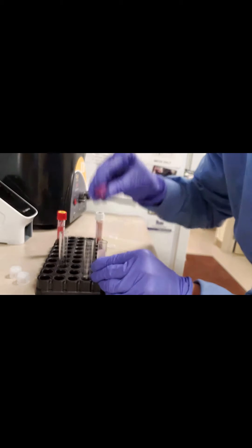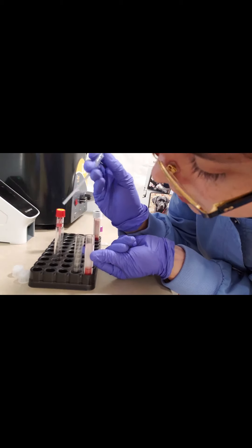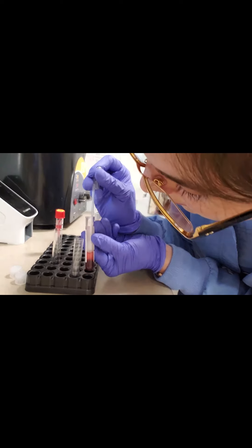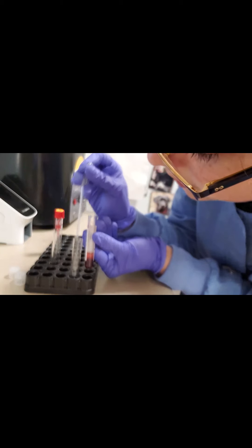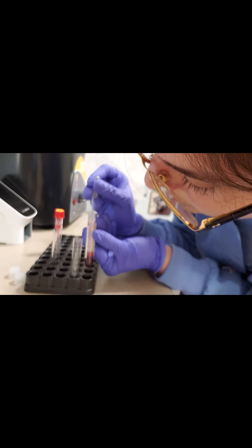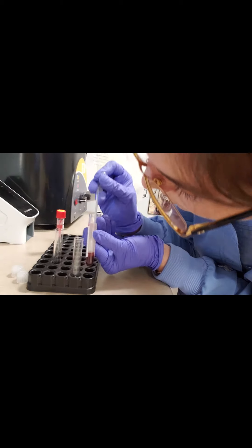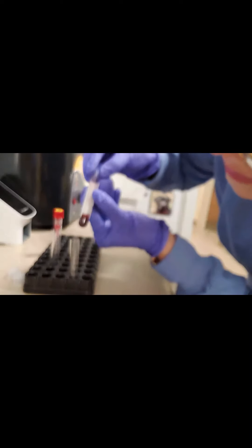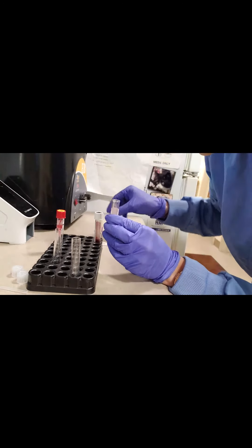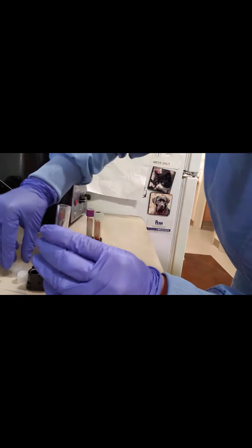Now our lavender top tube — with a fresh pipette — we want to make sure again that we are getting the plasma, not the serum, rather — not disturbing the red blood cells. Very gently with our pipette, we suck it up from this tube and then put it into our plain transparent tube. Now what's left is our red blood cells, and we can see we have our plasma there.